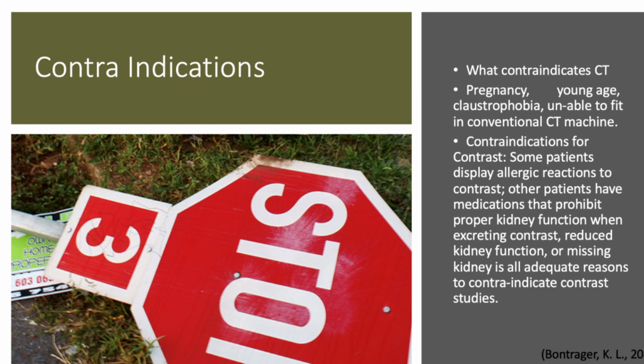Those are some other outside medical reasons. One in particular could be, again, contrast. Contrast is very important to CT scans, and it's very often done, so we have to be very careful when we use contrast on certain patients. Like we said before, anybody with impaired kidney function is at significant risk from these contrast studies. So we want to make sure they have functioning kidneys, that they don't only have one kidney, that they don't have, let's say, diabetic medication that we don't alert them not to take. Things like that. Or maybe they're allergic to the contrast. We have to be very careful with that because the contrast will seriously injure the kidneys if we don't take these things into consideration.